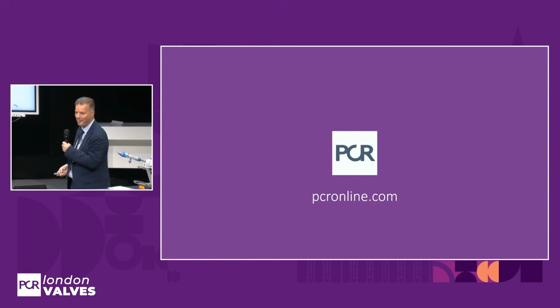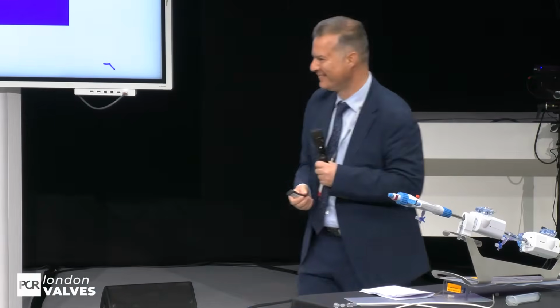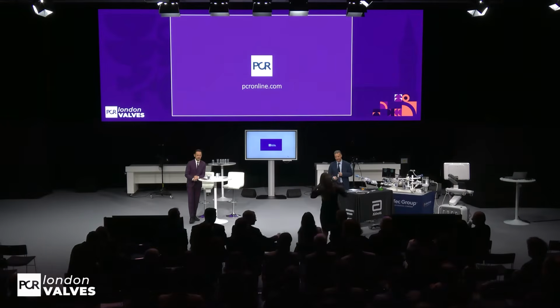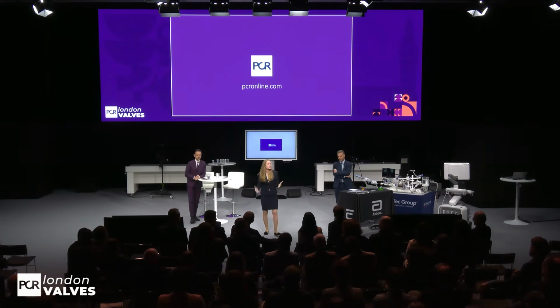Simple. Wow. Okay. I think we can agree on two very complex cases. So maybe, Erwin, what are your thoughts on the second case? RV function, more of a ventricular kind of case, maybe? What are your thoughts on what the challenges might be?